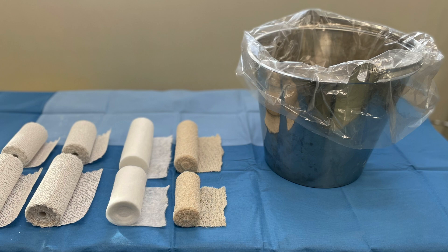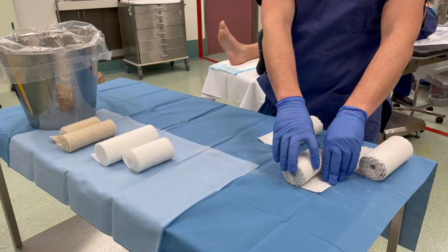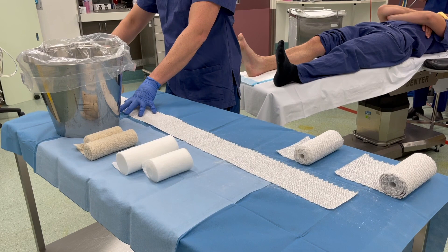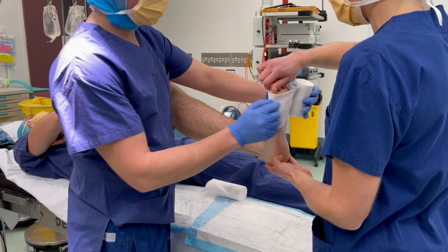The water used in the bucket is cold to give us a longer working time. With the patient lying supine we measure out the length of plaster required. For the back slab we measure from the metatarsal heads to approximately three finger-breadths below the knee crease, and for the U-slab we aim for a similar level hemicircumferentially around the leg. Using these measurements we prepare eight to ten plies of plaster for each of the back and U-slab.